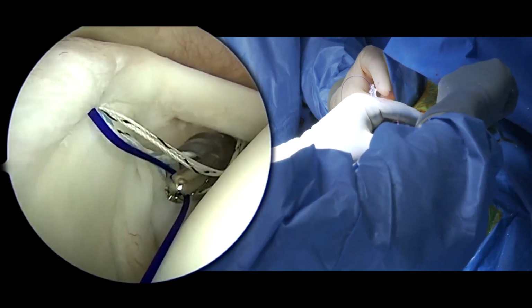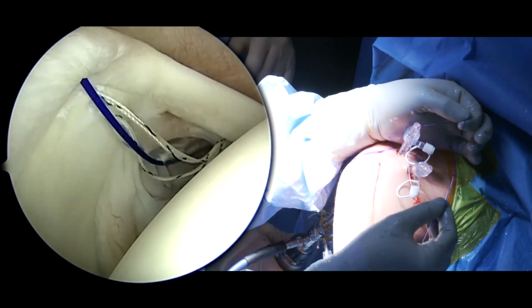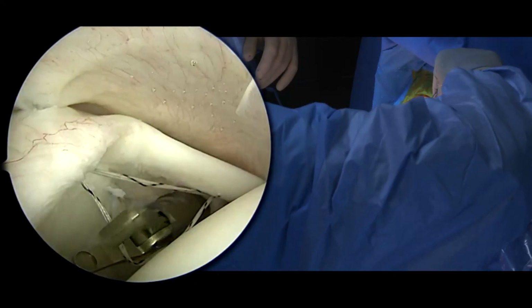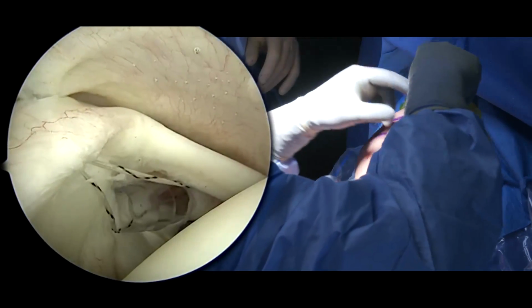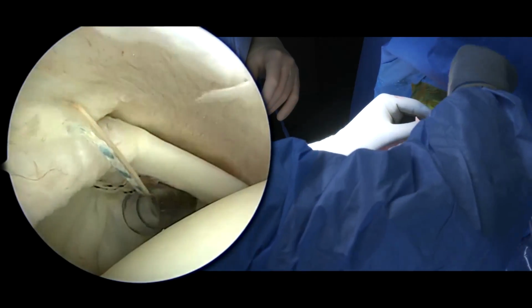and then re-engaging the posterior labrum. Utilizing the PDS suture, this works as a passing suture for the working blue suture, as seen here, through the glenolabral junction just posterior to the biceps root. The looped end of the shuttling suture, as well as the working suture that is blue in this case, is shuttled out of the high anterior interval portal.